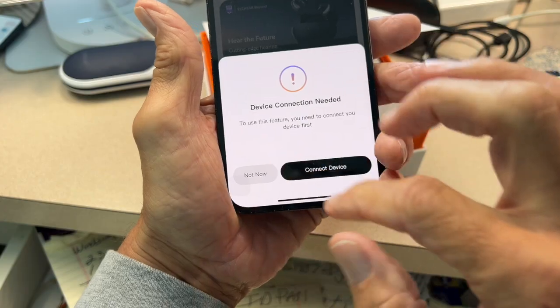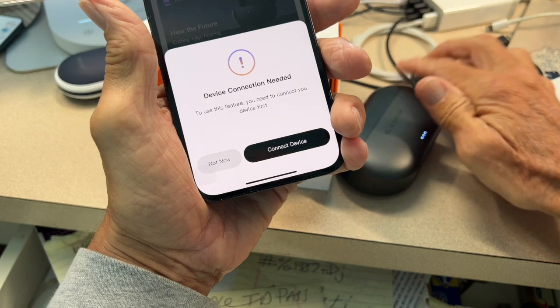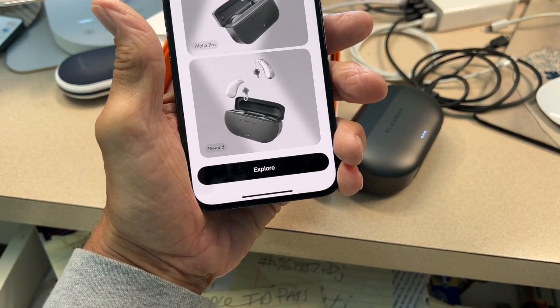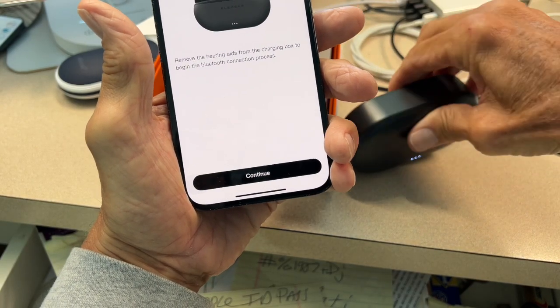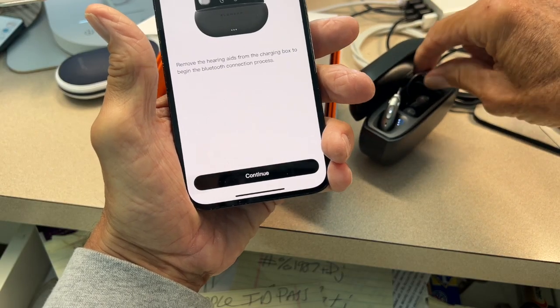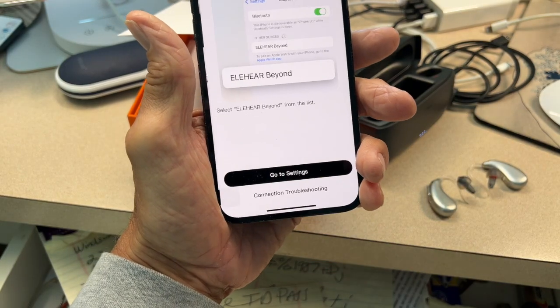Device connection needed. All right, let's connect our device. So our device is right here, right? Here it is. Now let's see if we can connect it. All right, I got to select. Preparing connection. Remove the hearing aids from the charge box to begin Bluetooth connection. All right, so we have to pull these out. Uno and dos. So I pulled them out. Now I'm going to hit continue.